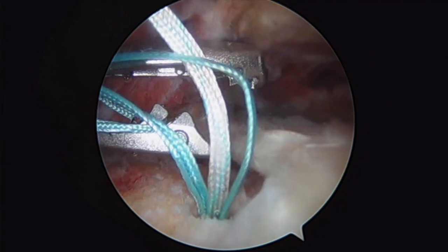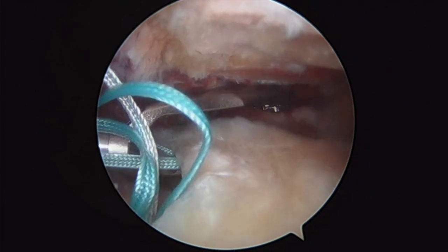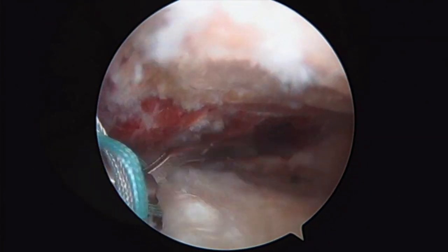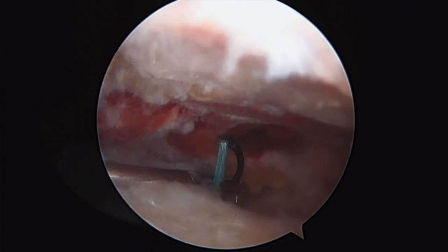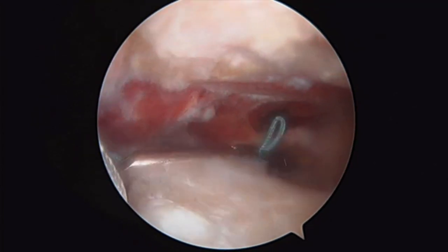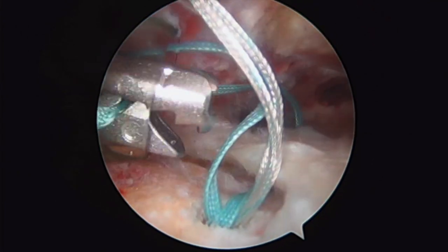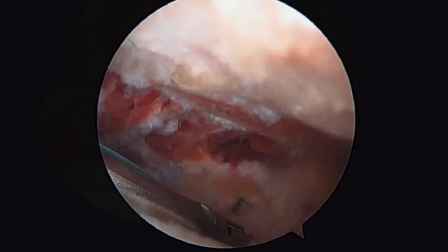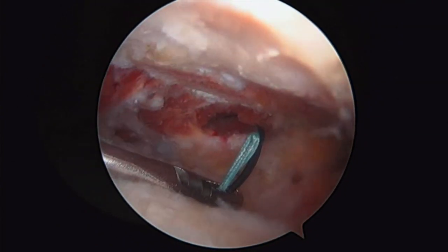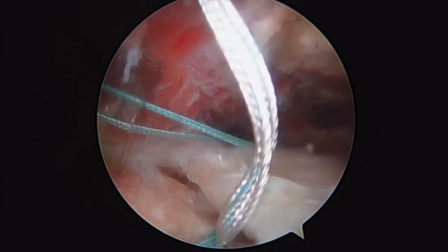And this will show you how we shuttle our sutures. This is a suture passing device. I've loaded our suture onto the passer, and then I'm going to come here more anteriorly for our first bite. This passes the suture through the rotator cuff, grasps it, and allows me to bring it back out through the shoulder. And then suture number two coming in here — I'm just going to go a little bit posterior to our first pass. There you can see it being shuttled. There's our first suture passed.